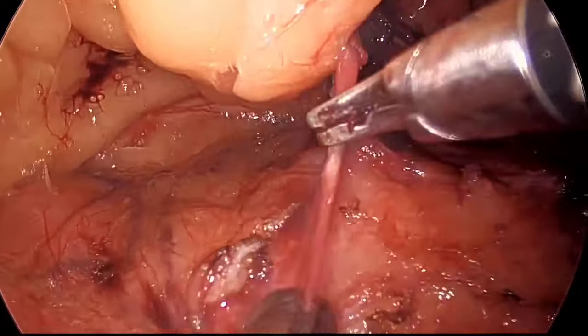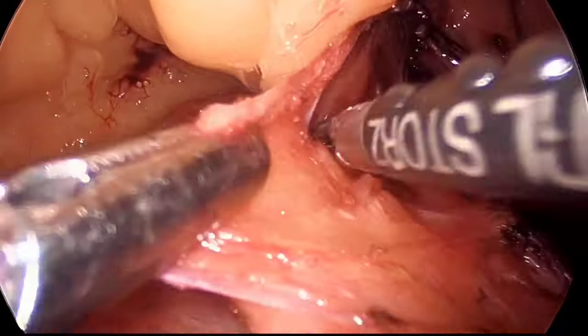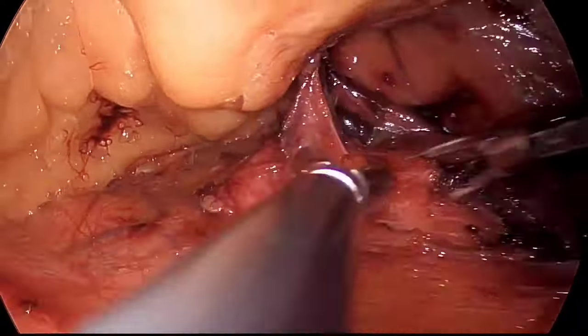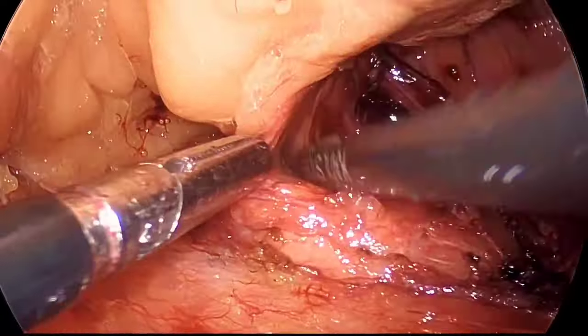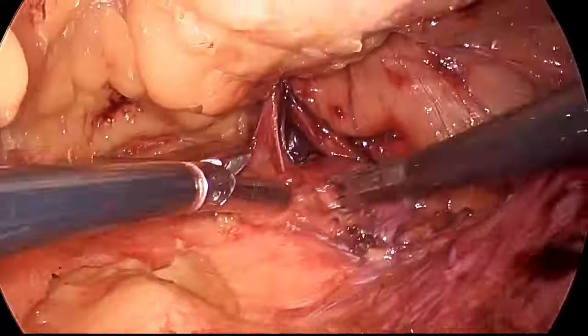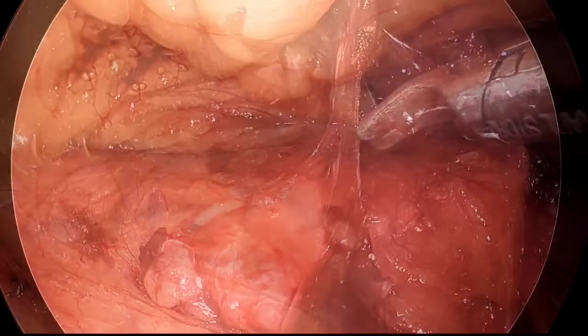Safeguarding both structures, I'll be doing the parietalization. Once I'm beyond the defect margin, I'll release the peritoneum from the cord structures, so that I can achieve the critical view of the myopectineal orifice nicely.